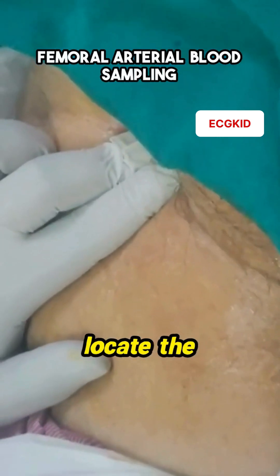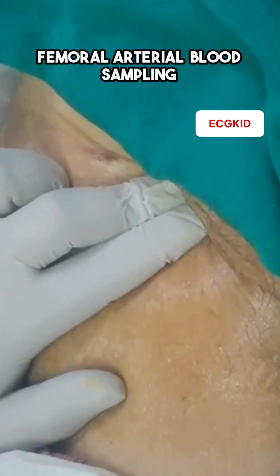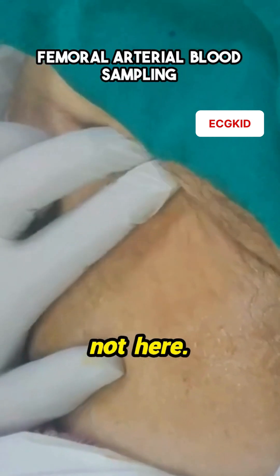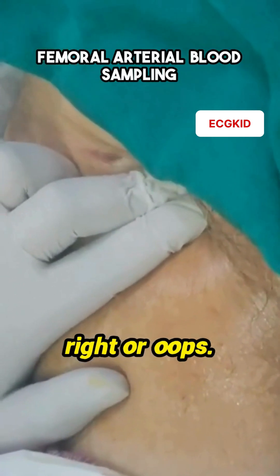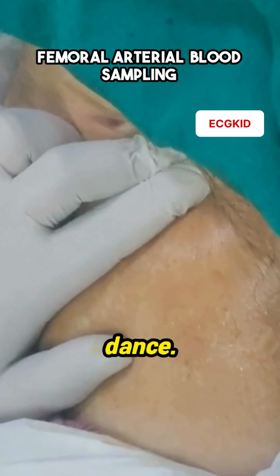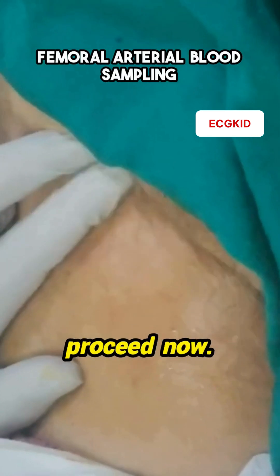Next up, we need to locate the femoral artery. This is the part where we pretend to palpate the artery. Here it is — wait, not here. What about here? I'm pretty sure it's right here — oops. Finding it can be a bit of a dance. But hey, once we're confident, or at least confident-ish, we're good to proceed.